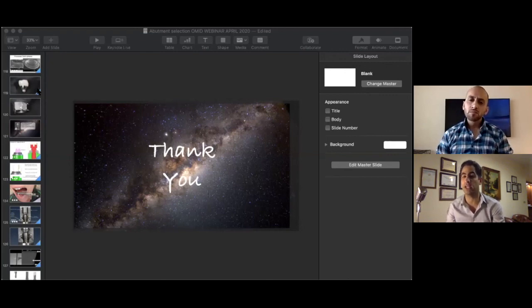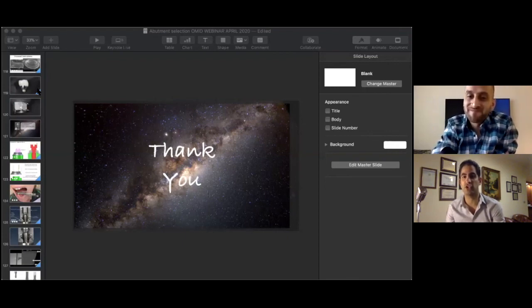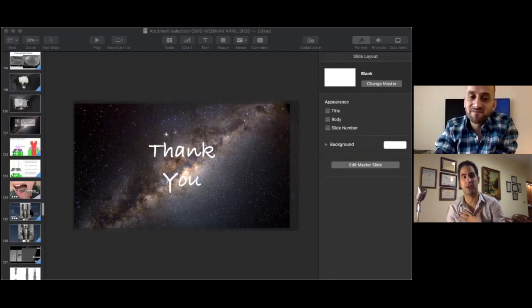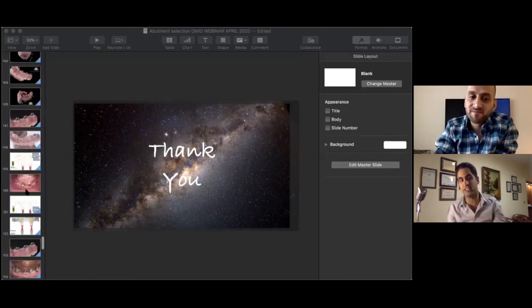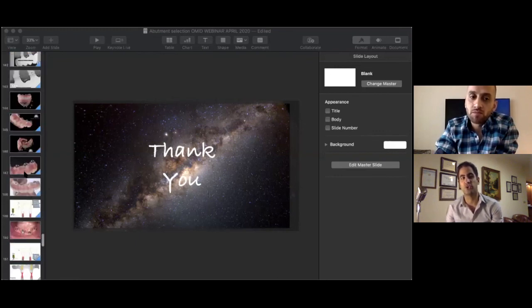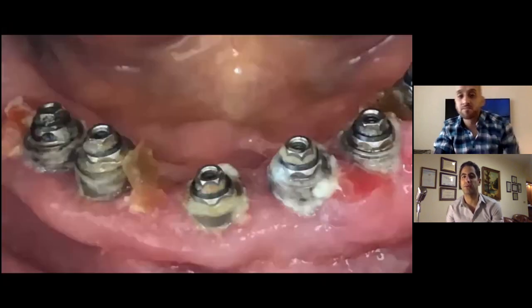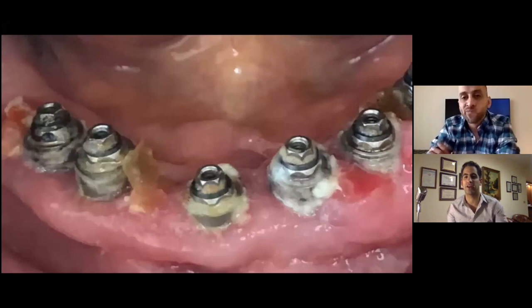And I think it was pretty clear, all the topics. And one of the things that I loved about it is the passive fitness of the crowns, and most specifically in the full arch cases, because that's one of the issues that usually, I'm a surgeon, I'm not a prosto guy, but that's one of the things that usually can lead to complications. And as far as I understood, also in your presentation, I think the recommendation is going to be segmental prosthetics and not a full arch prosthesis in one piece if we don't go with a passive abutment, right? Can we say that?